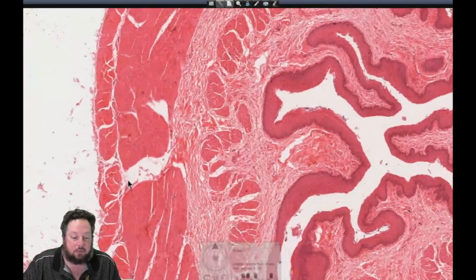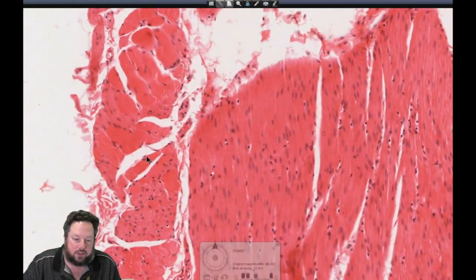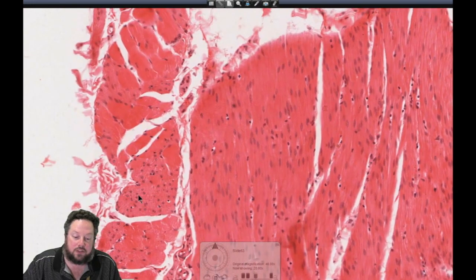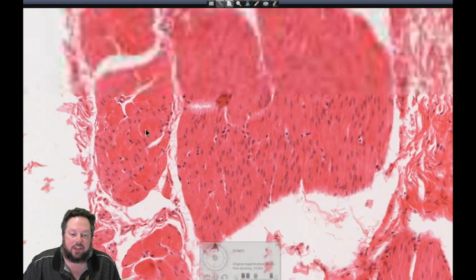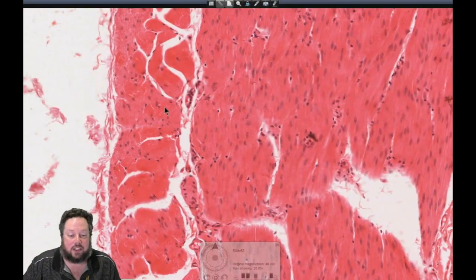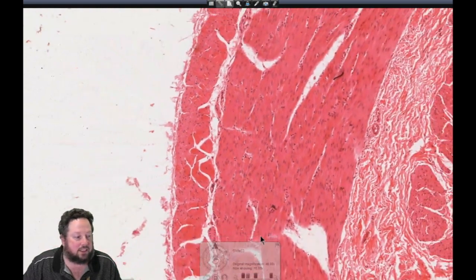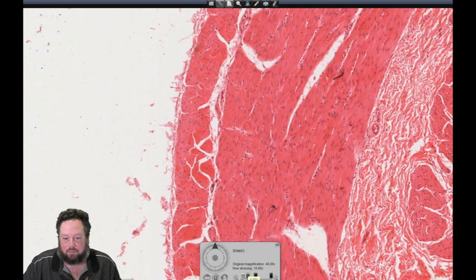Unless anyone has any more questions about the esophagus, we'll zoom out here, just showing some of these skeletal muscle fibers amongst the smooth muscle here. I always love seeing this. Such a bizarre thing to have skeletal and smooth muscle fibers together in the same place, I think. Personally anyway, I think it's kind of cool to see them side by side and amongst the same tissue here. But that's just me. Also a really good way to see the difference between them.